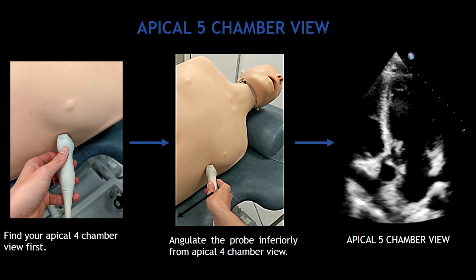Next is the apical five-chamber view. To obtain this view, you have to find the apical four-chamber view first. Once you have your apical four-chamber view, you are going to angulate the probe inferiorly. With these two steps, you are going to be able to get your apical five-chamber view. Remember that the index marker should still be pointing to the couch.